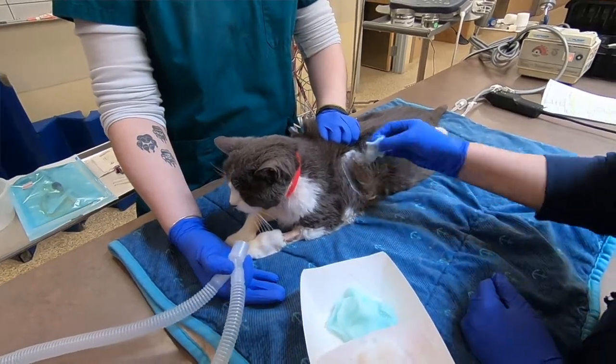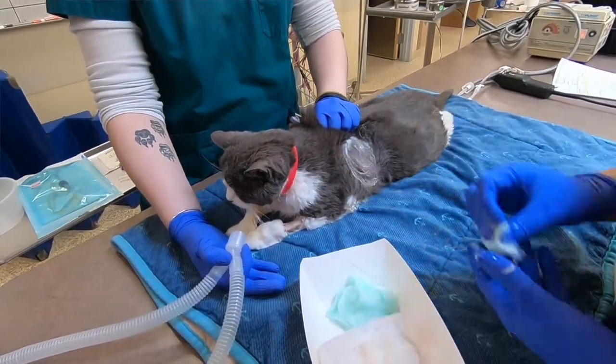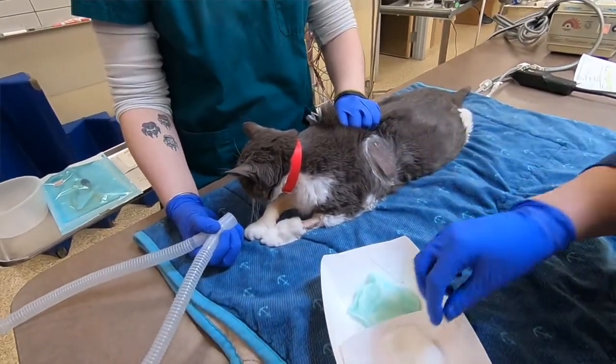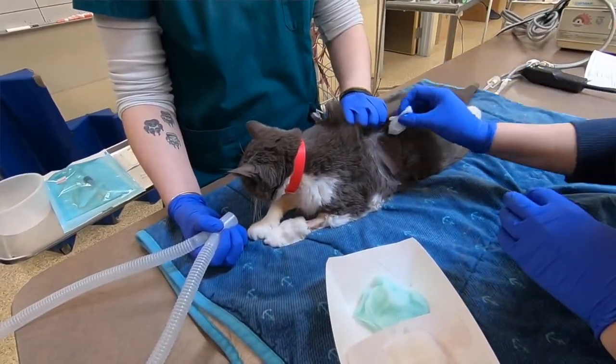You're then going to clip and prep an area where you think you're most likely to find fluid ventrally, or if you're looking for air, you're going to be dorsally. For fluid, I like to go about the 8th to 10th intercostal space, and about the 10th to 11th space for air, dorsally. For fluid, I'm going to go right at the costochondral junction.